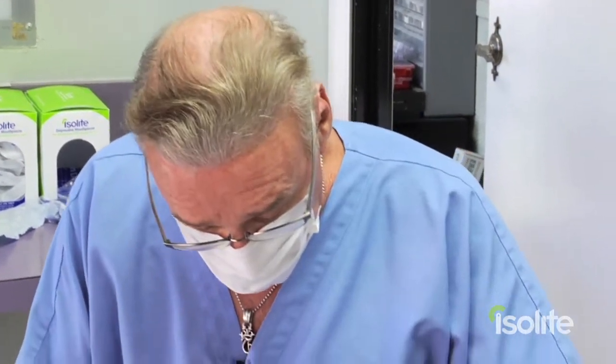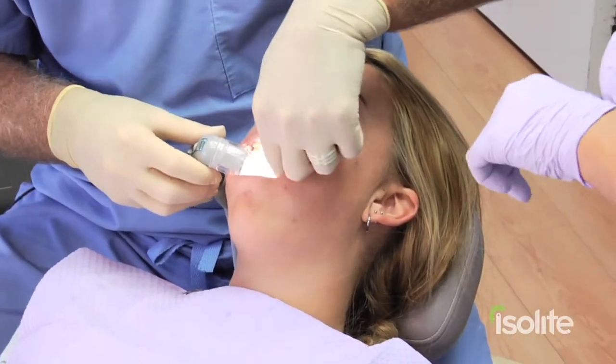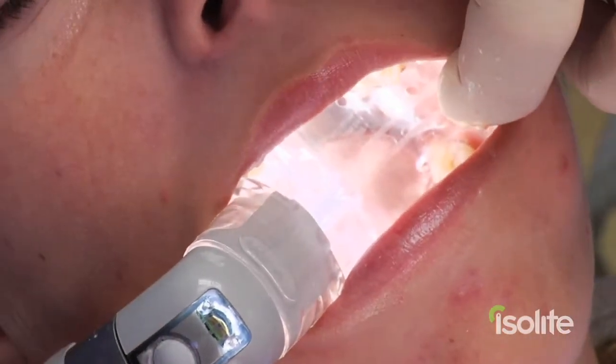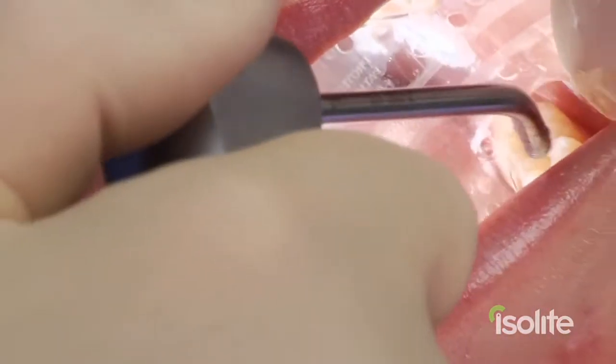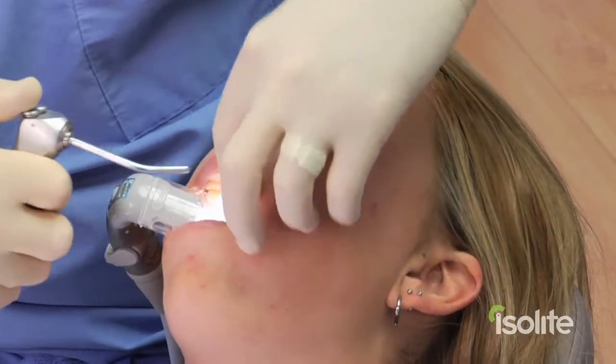With the additional curing time we're going to need, it'll probably be five to six minutes to do the eight sealants. We're going to be doing the first and second molars on our patient here. Open real wide. Put the Isolite in — slips in in about three or four seconds, and just have her close down on that. Simultaneously, we're going to be aspirating the upper and lower arches at the same time.